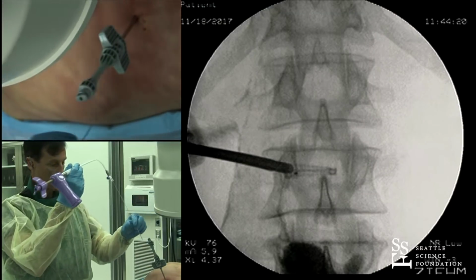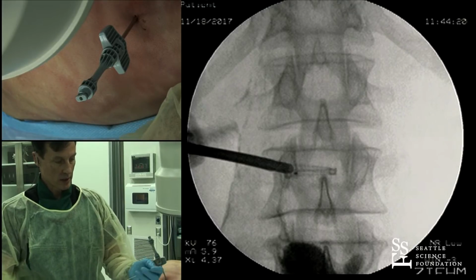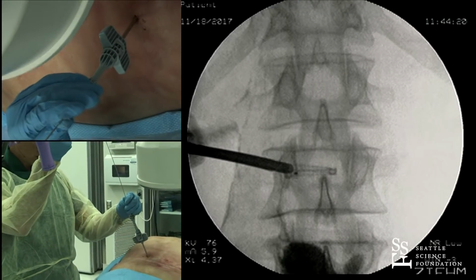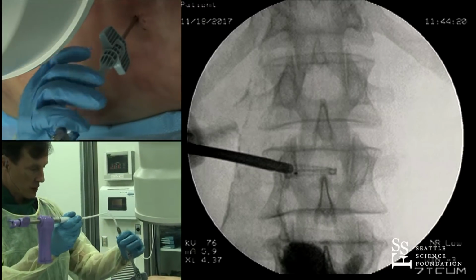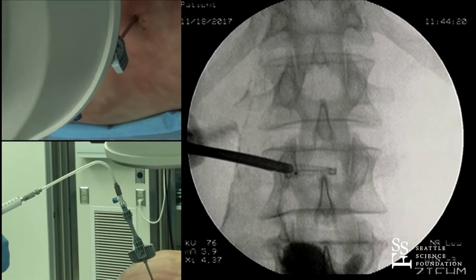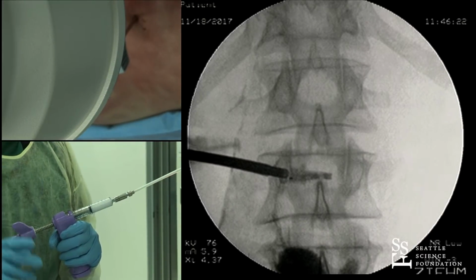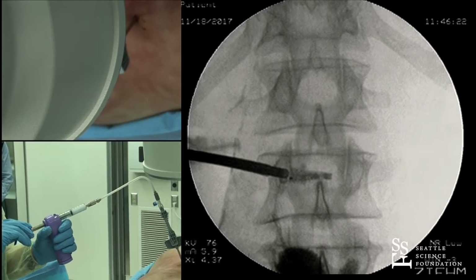This device has a little flexible tip on it, and it's got a little cement, so we'll pull that off. And this flexible tip is designed to fit down inside the coil. So it's a test of your presbyopia to see if you can actually fit it on there. Okay, so it fit pretty nicely. We will see some of the cement coming out already, and of course we're going to fill the cement on the lateral, so let's take a look at the lateral.